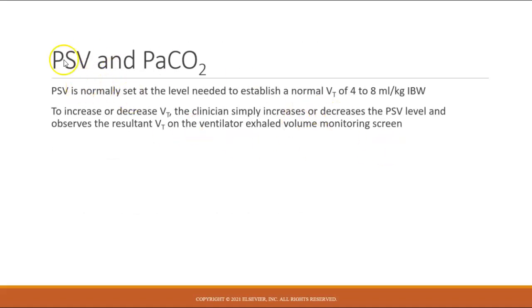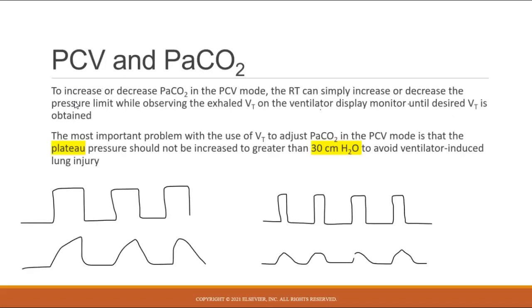Okay. Again, this is just reiterating the fact that your pressure support should be set at a level needed to establish a good tidal volume per their body weight. If I want to increase or decrease their tidal volume, I could simply increase or decrease that amount of support that I'm giving.